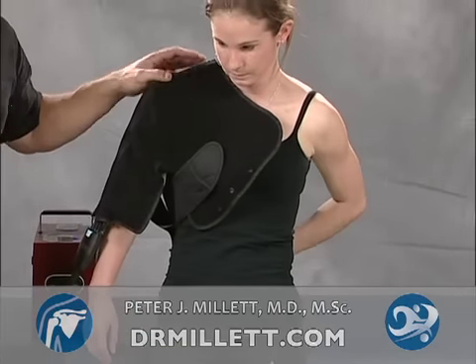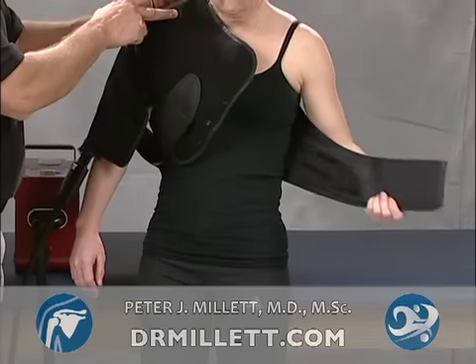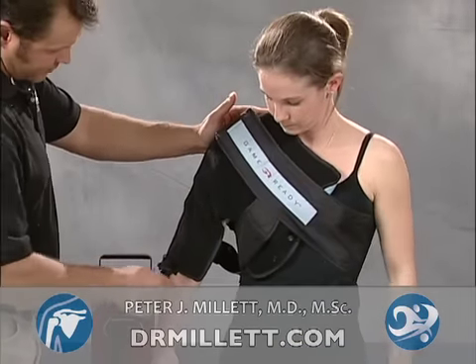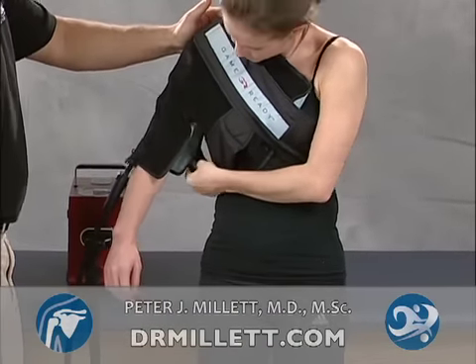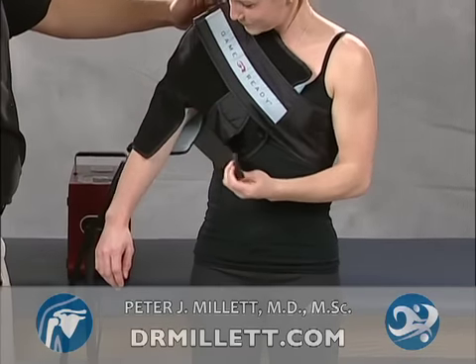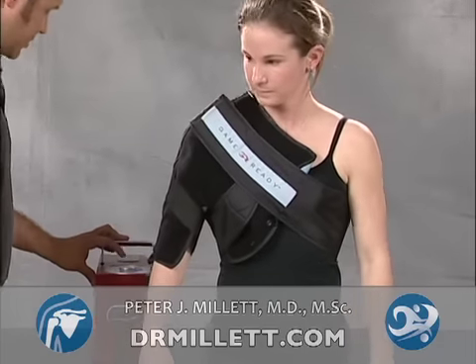With your left hand, reach behind you. Strap that one up as high as you can toward your shoulder. There's one more tab right under the elbow here. Can you get it? There we go. Good. Now you can turn the machine on.